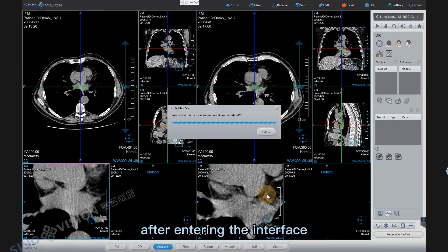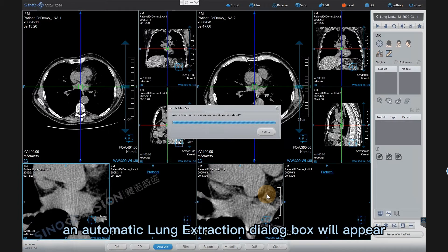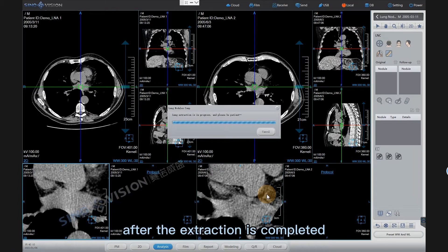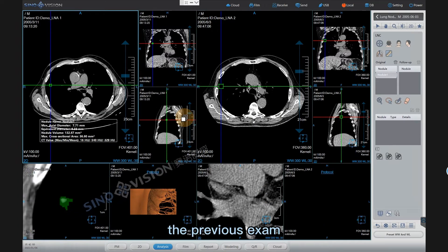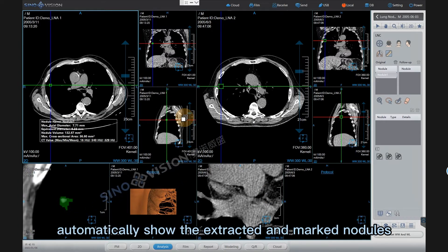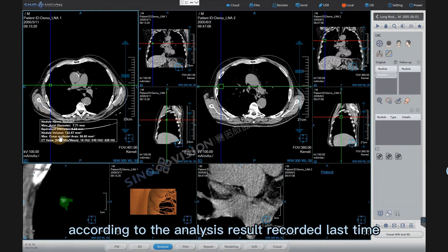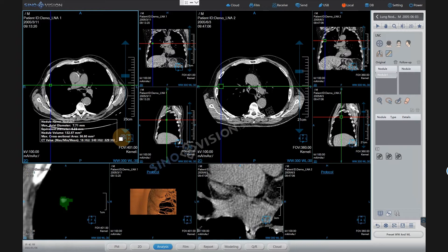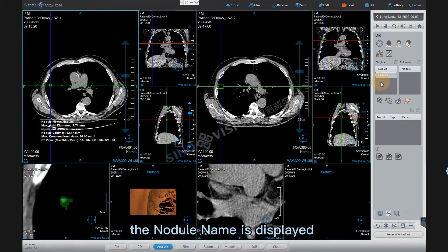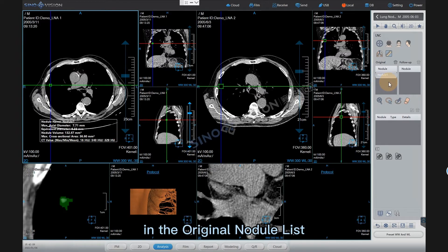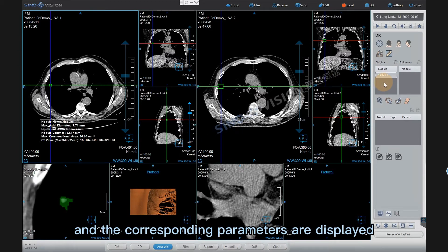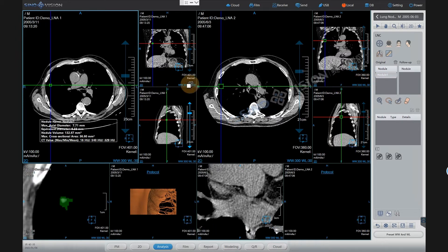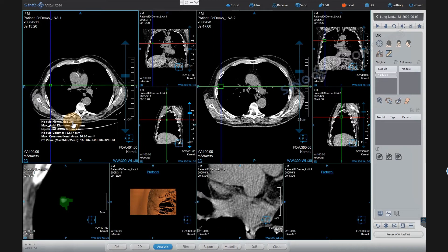After entering the interface, an automatic lung extraction dialog box will appear. After extraction is completed, the previous exam automatically shows the extracted and marked nodules according to the analysis result recorded last time. The nodule name is displayed in the original nodule list, and the corresponding parameters are displayed in the axial image viewport, such as nodule name, diameter, volume, CT value, etc.